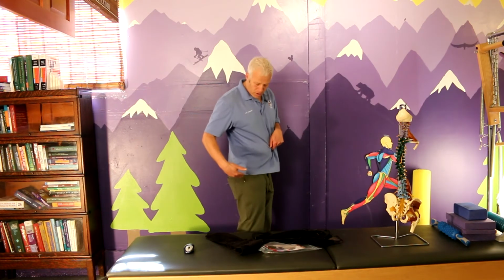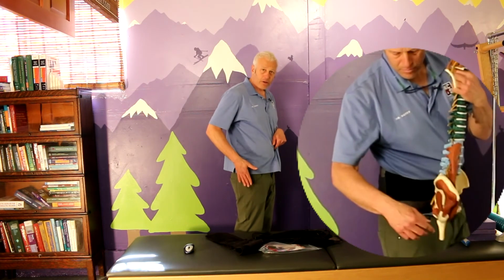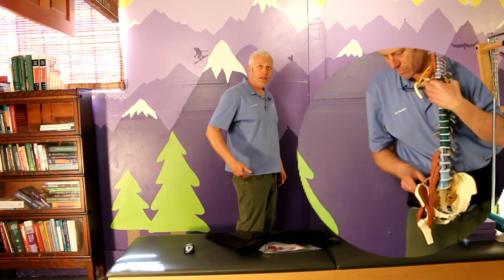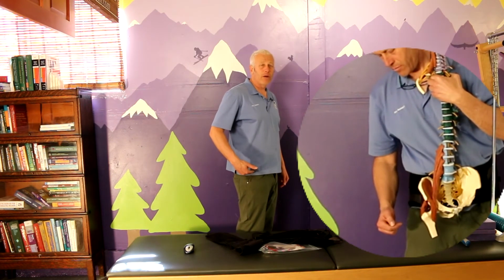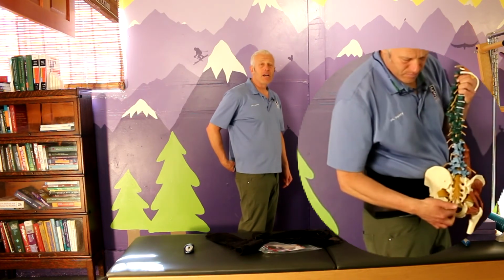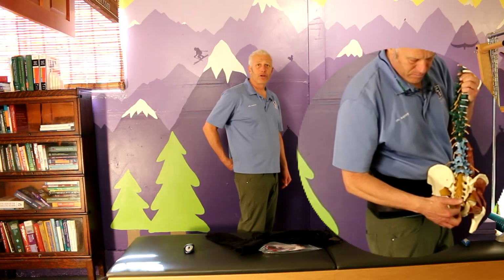If you put your hand on the side of your leg here, you're going to feel a bony prominence. We call that bony prominence the greater trochanter. That bony protrusion, the greater trochanter, is at the same level as the coccyx. And the coccyx is where the bottom of the Core Fit brace should be.